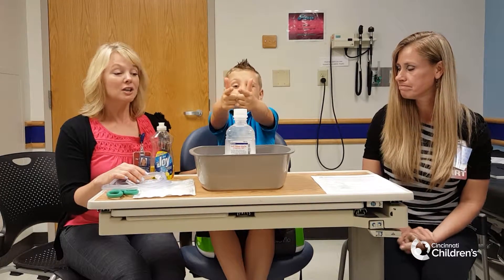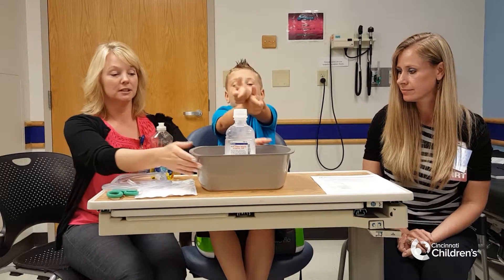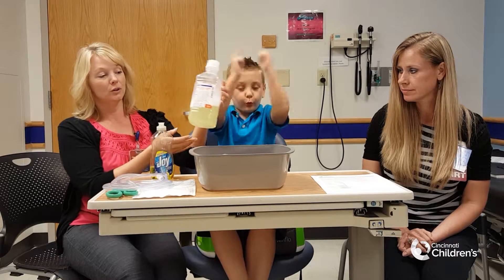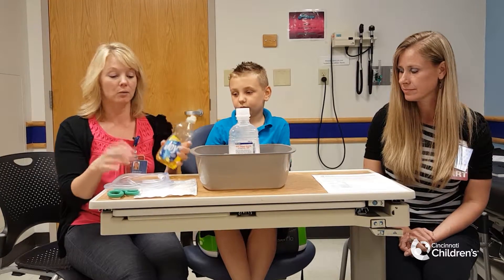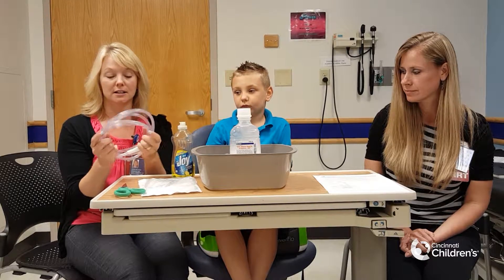Caroline will tell you how it's set up. Basically what you need to set this therapy up is a typical wash basin that you have on the floor. We use a thousand milliliter bottle of either sterile water or normal saline, a bottle of Joy or some kind of soap, and some suction connecting tubing.